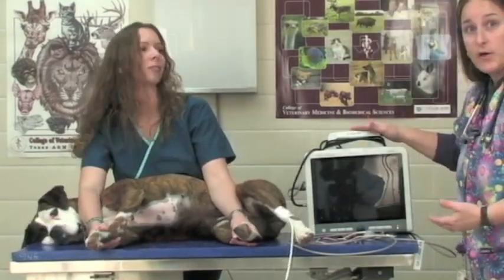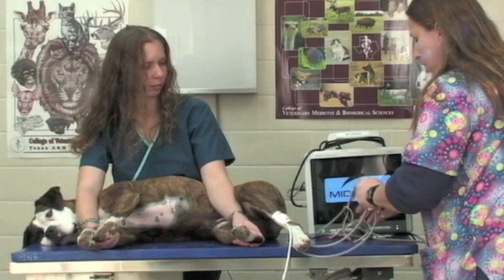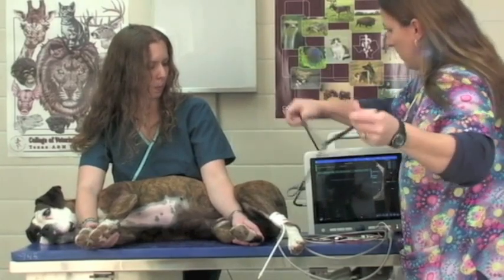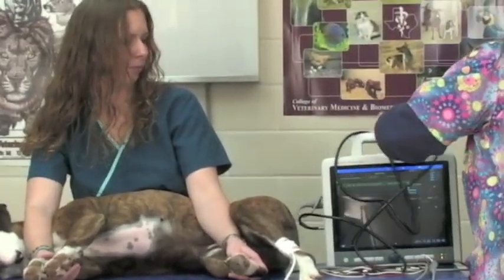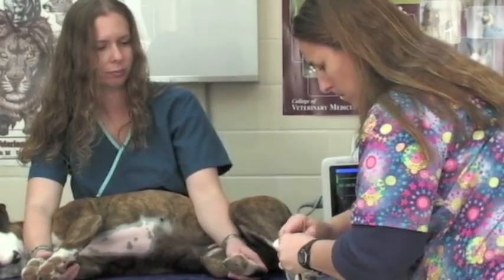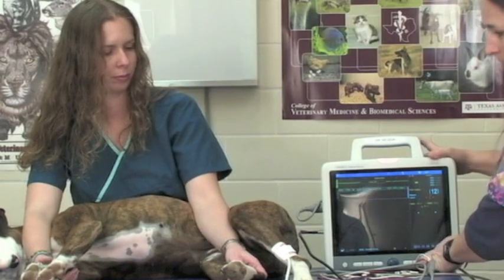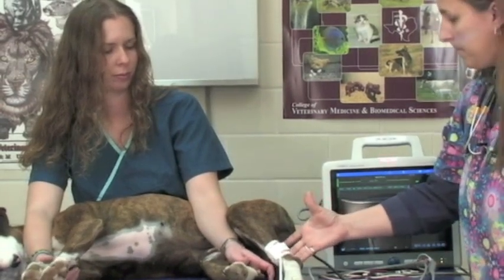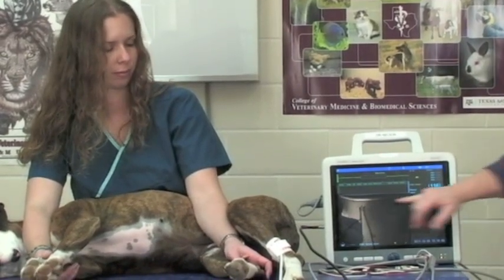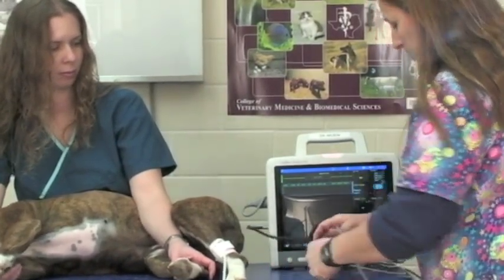That is our very loud Cardell machine. The Cardell is going to measure our blood pressures for us and our ECG. Is it underneath it? There we go. And then I'll start the blood pressure, and the cuff will increase, okay? And then you'll notice over here that it's actually reading, and then it'll pop up and give us a reading, and it'll bring it right down here as well. While that is measuring, we can go ahead and hook up our ECG as well.